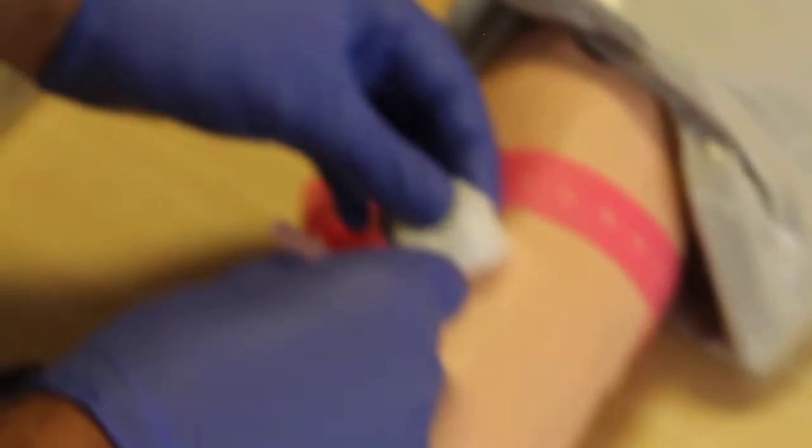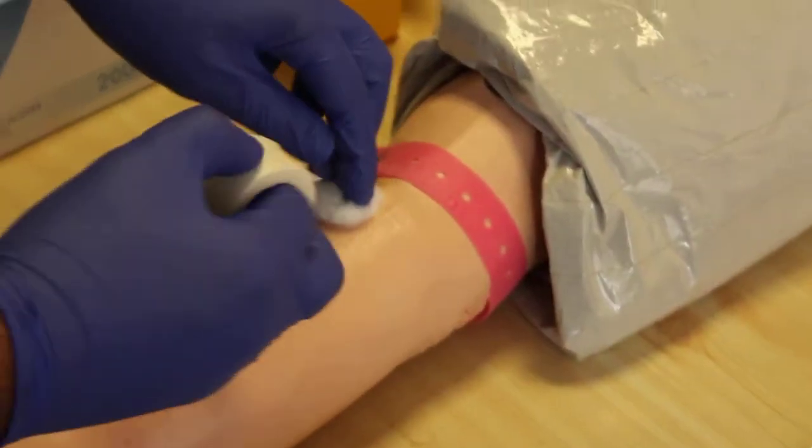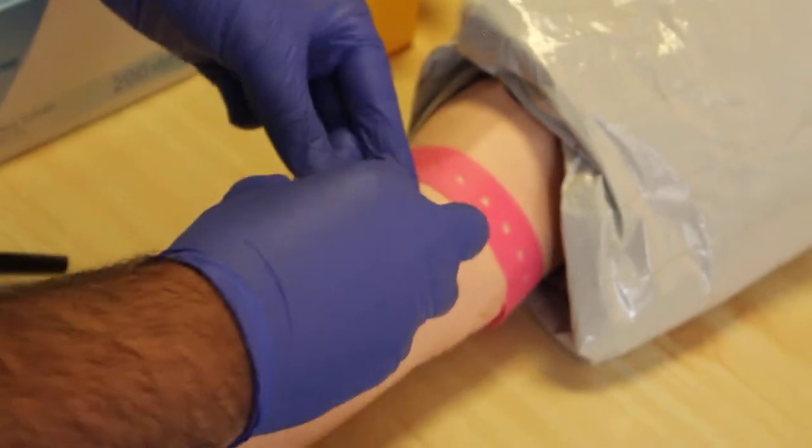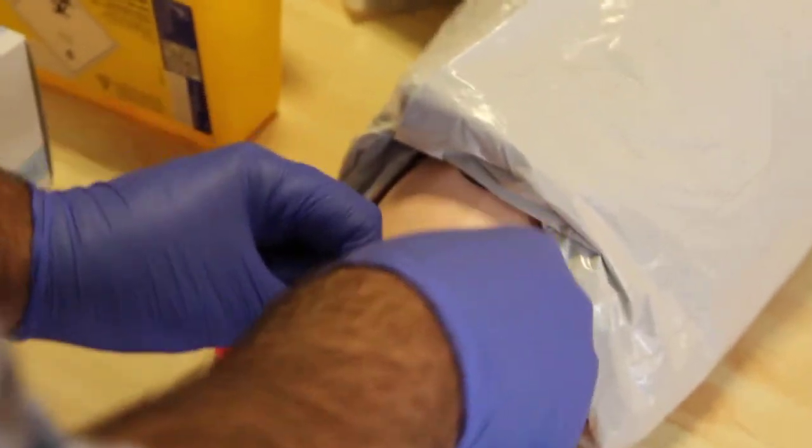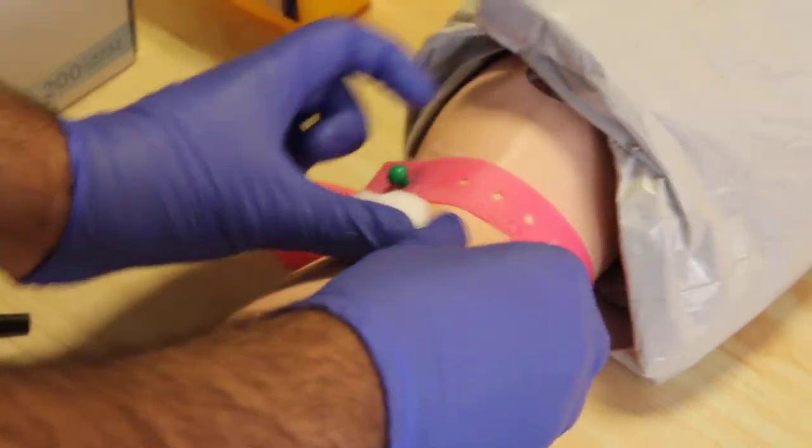Open the tourniquet. Take the cotton, put it on top, take the needle out, and put it straight into the sharps bin first thing. After that, you can take a piece of tape to hold this temporarily on the patient.